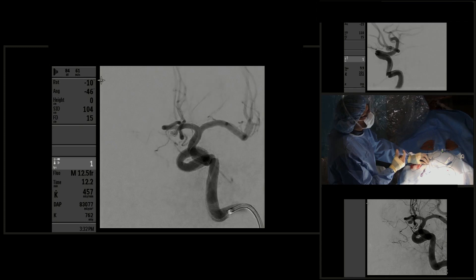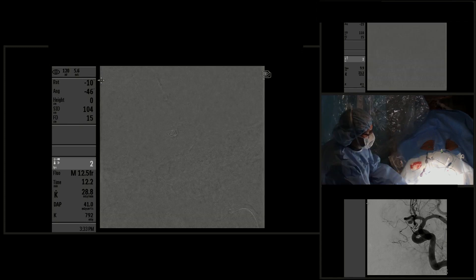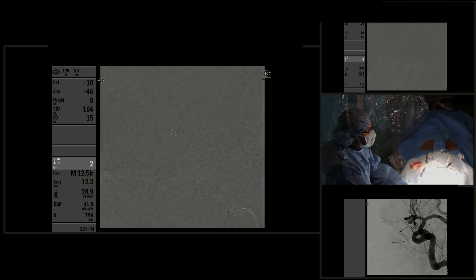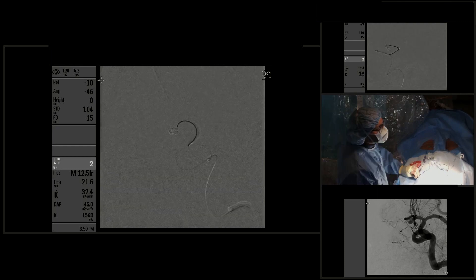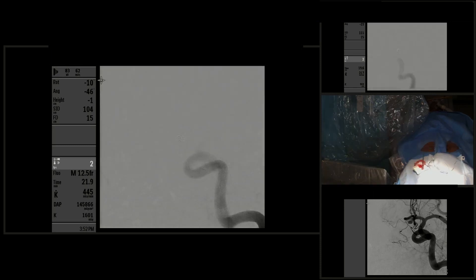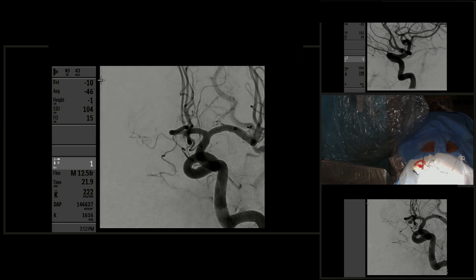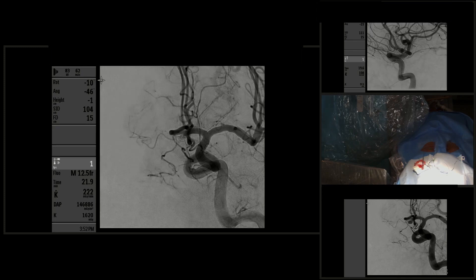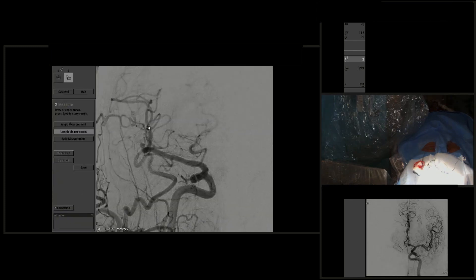You can see that the coil is in the correct place. We ended up putting a total of five coils into this aneurysm, downsizing from 4 millimeters to 2 millimeters, 1.5 millimeters, and then two 1-millimeter coils. This is the DSA examination angiogram at the end, showing obliteration of the aneurysm.